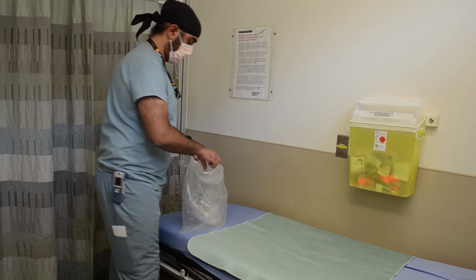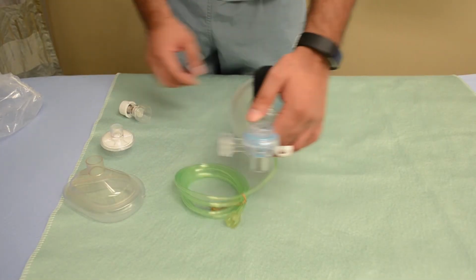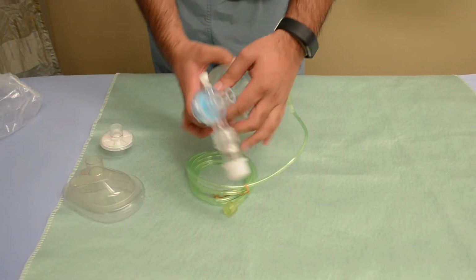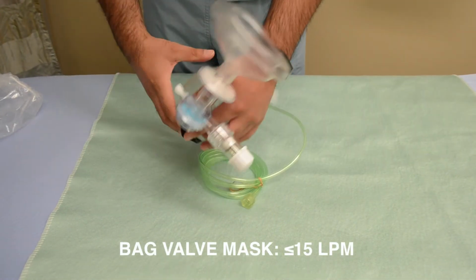Bag valve masks are kept in a clear plastic bag in each patient room in major and RAS. They are stored with oxygen tubing, an antimicrobial filter, and a PEEP valve, all of which need to be attached before use, as we are demonstrating here. Oxygen flow rate for the bag valve mask should be set to a maximum of 15 liters per minute to help avoid aerosol generation.